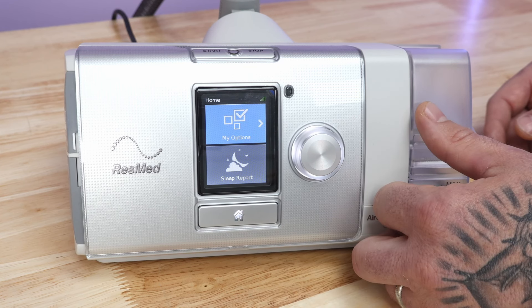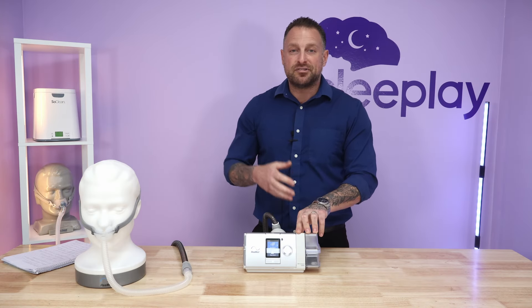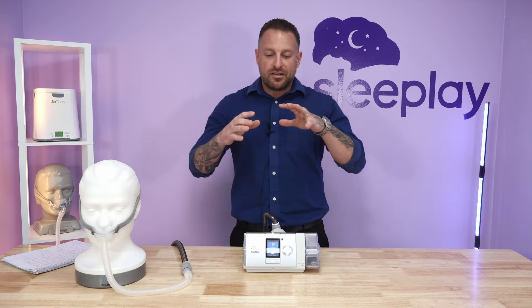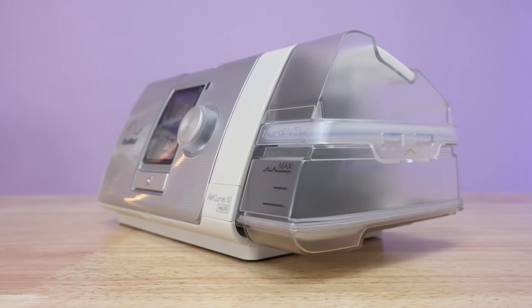This is the AirCurve 10 V Auto by ResMed. There are many BiPAP machine options, but here's a key difference between BiPAP and CPAP: CPAP is continuous pressure, while BiPAP is bi-level — two separate pressures. IPAP is the higher pressure on your inhale; EPAP is the lower pressure on your exhale. There are different variations: the standard spontaneous mode is a regular BiPAP, while the auto mode adjusts automatically to meet your breathing pattern needs on both inhale and exhale.